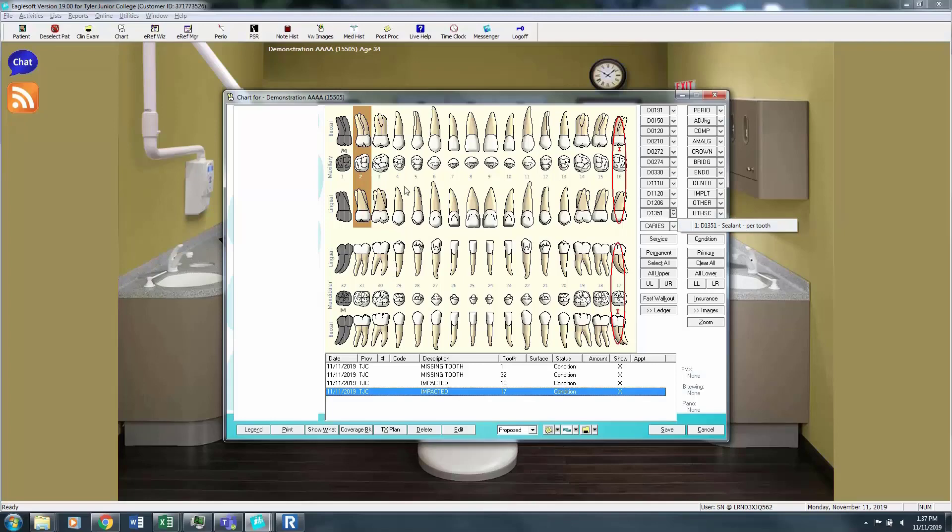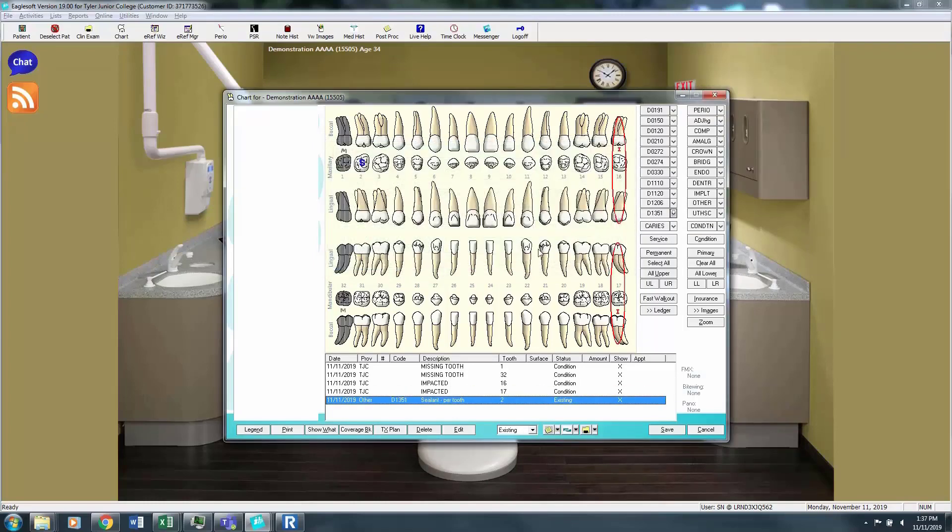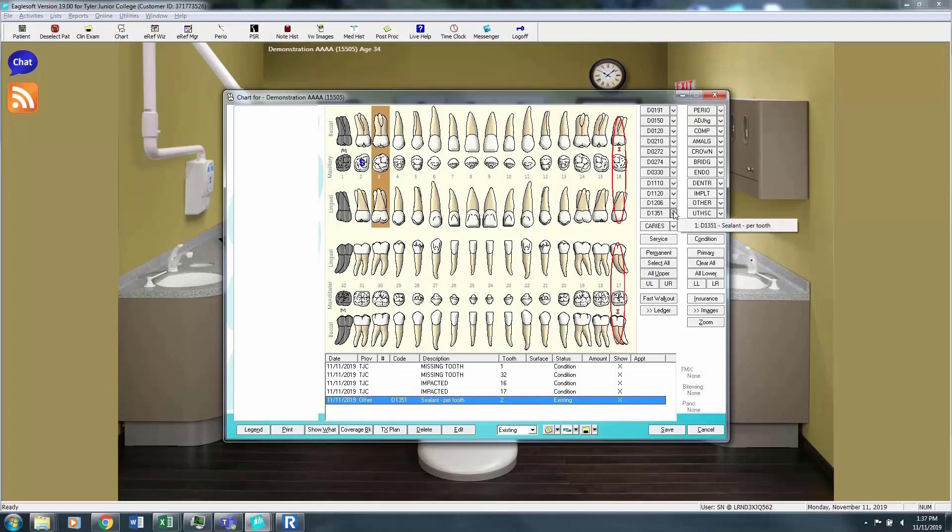So you can click any teeth that have sealants whether they're existing or proposed. Click your sealant and either propose or state that the sealant is existing. So we're going to say that this patient has an existing sealant on number 2. We're going to propose a sealant on number 3.